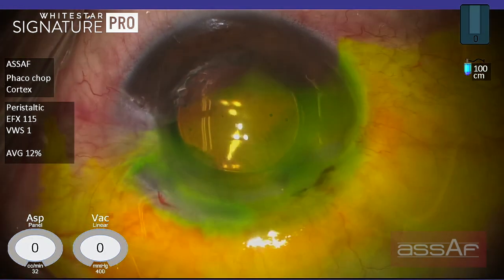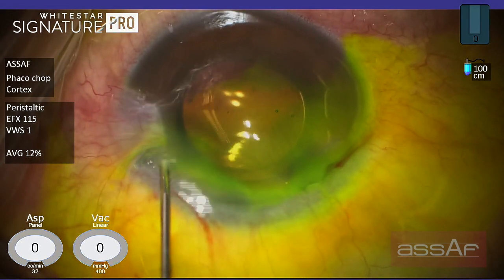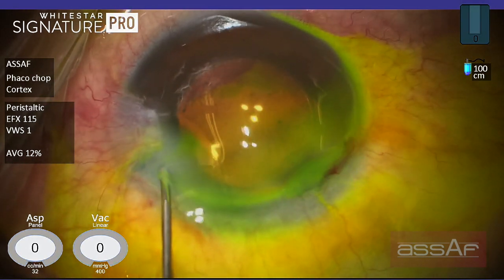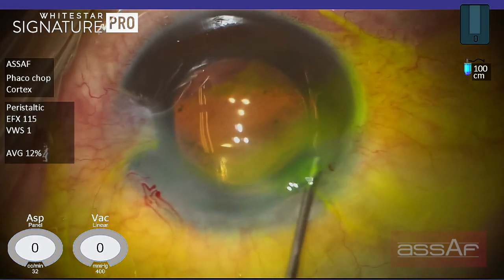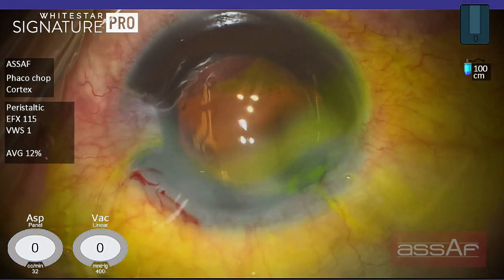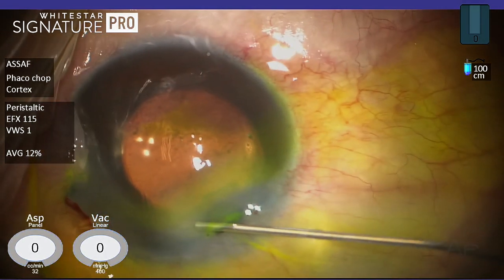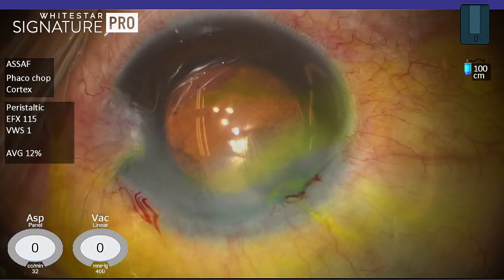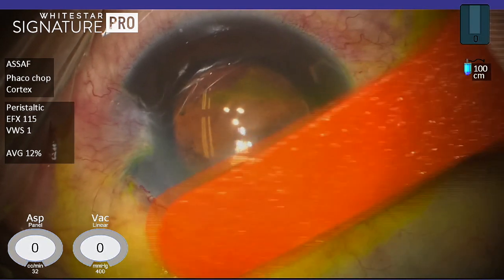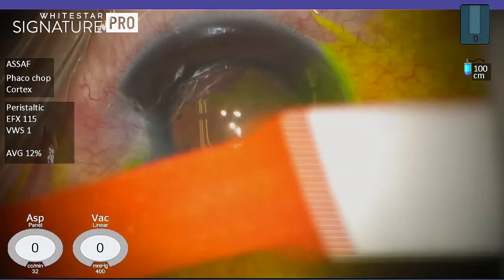Now applying the Seidel test to test for wound leakage. The main wound is almost self-sealed; the side port may require some stromal hydration. A little bit of stromal hydration to make sure that the main wound is self-sealed at the corners and at the roof of the main incision. Double checking again by applying the fluorescein Seidel test to make sure that the wounds are self-sealed before conclusion of the surgery. Thank you very much.